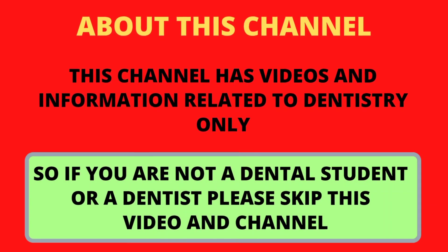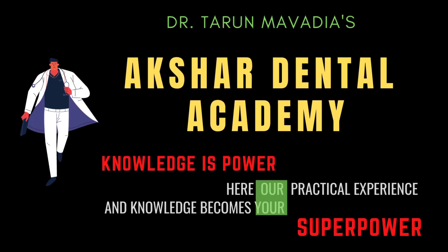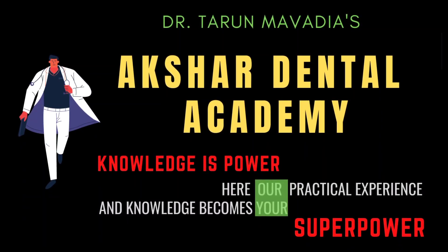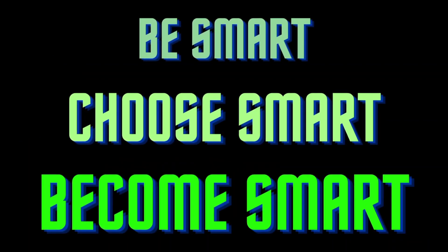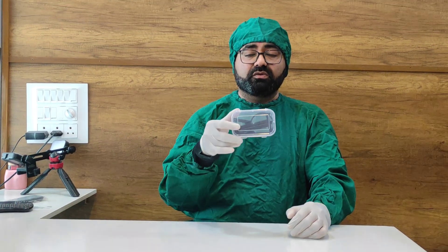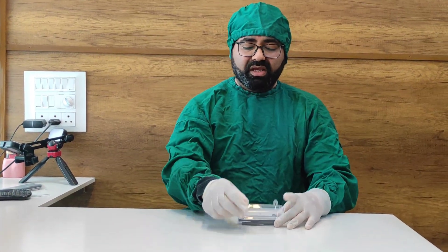Doctors, my name is Dr. Tarun Mavadia. I am from Akshar Dental Academy. This is what you are going to receive. When you receive the package, there will be an outer box and inside you will receive a plastic coverage. When you open up the box, these are going to be the contents.